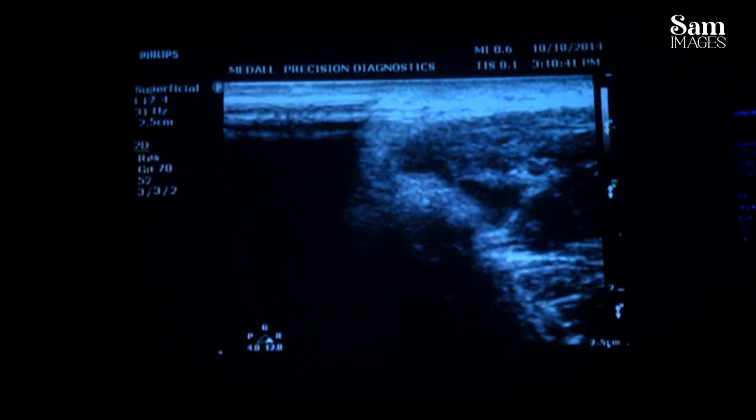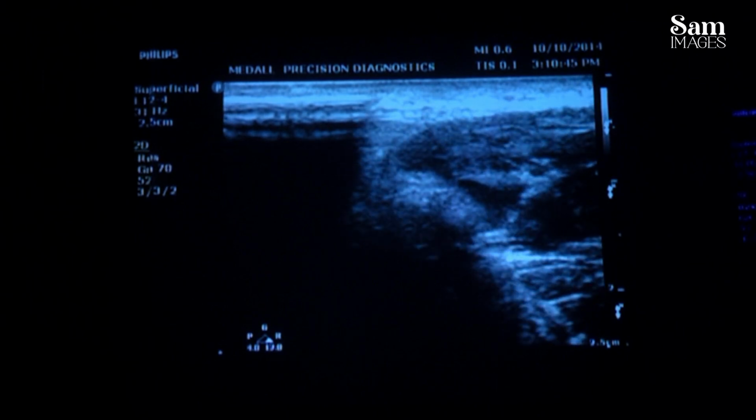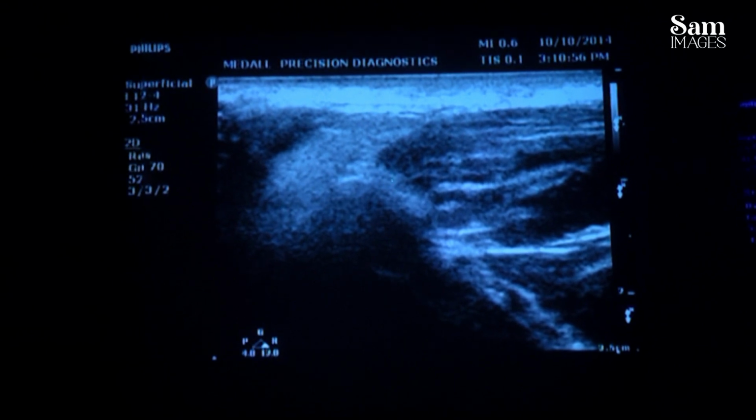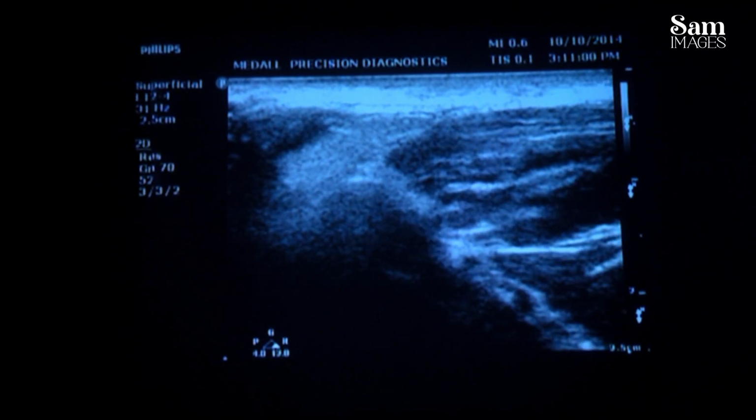Freeze. Roll back. See, that white line is there, no? That smoothness has to come. Yes, that is the smoothness. If there is any irregularity in that, the condyle is irregular and osteoarthrosis or ankylosis is suspected. The black area, that hypoechoic area you are seeing, is the articular disc. These two things only, open mouth and closed mouth, and the dynamic action, you assess the temporomandibular joint.